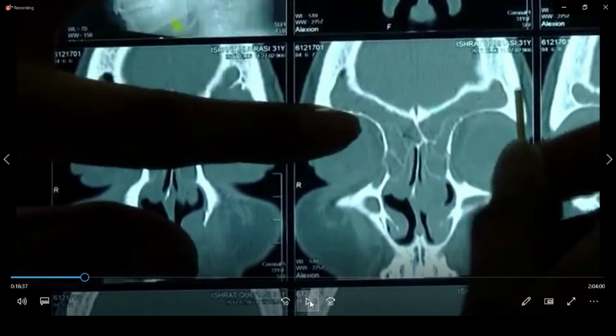Because the sinonasal anatomy is so variable. The close proximity to critical structures, skull base, orbit, carotid artery, optic nerve, sometimes makes the possibility of complications make the surgeon nervous, avoiding going close to these structures. All this fear can be shattered with a good CT scan, by understanding a good CT scan. And nowadays we prefer using the DICOM format, three-dimensionally in a dynamic format, so you get to know the three-dimensional anatomy of the region where we are operating.